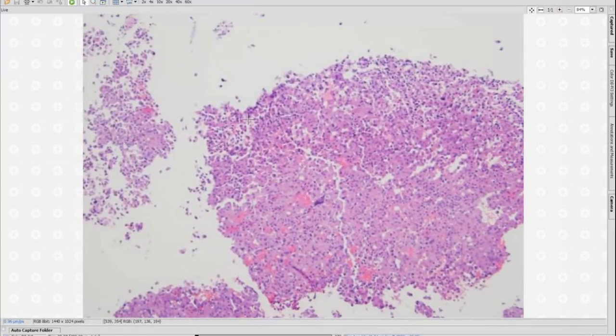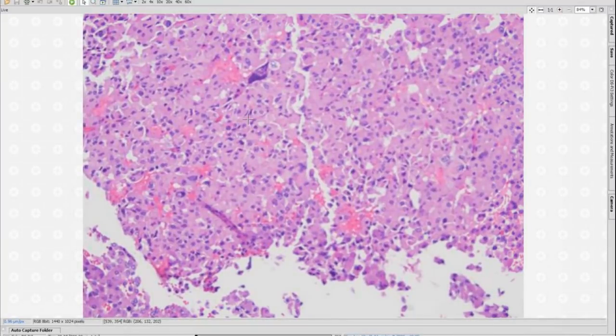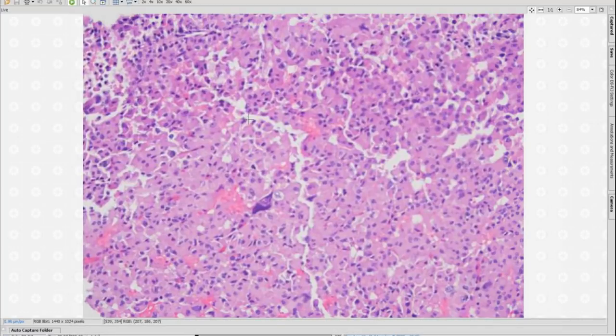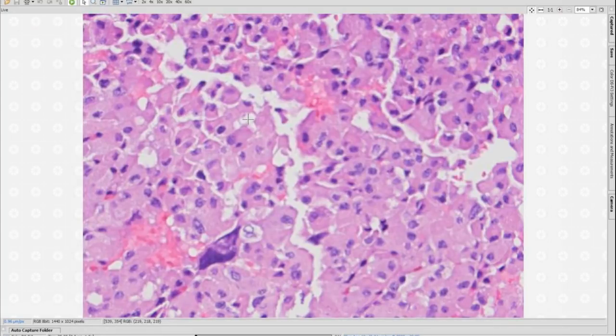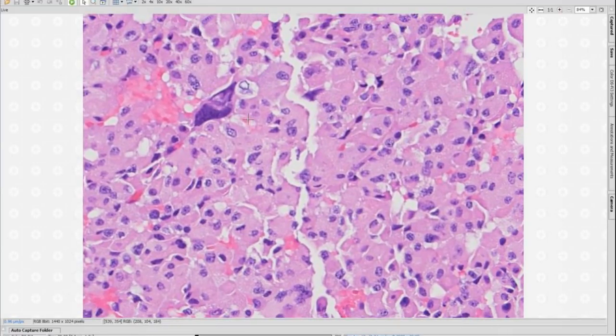And this is the lesion. Again, you're in the pituitary, you have an endocrine problem, so it makes it a little bit easier. That's something that's very useful in evaluating this lesion. If you have a very nice endocrine evaluation prior to receiving the specimen, and you see a single cell type, large cells, you can argue there's a slightly granular, slightly basophilic cytoplasm. Rare pleomorphic cell.